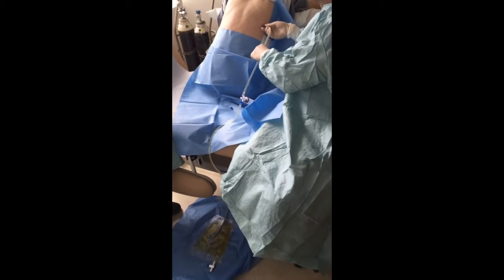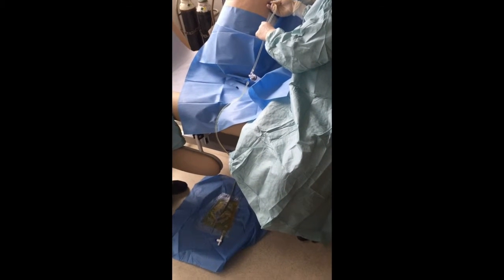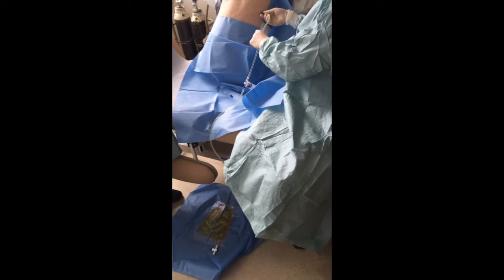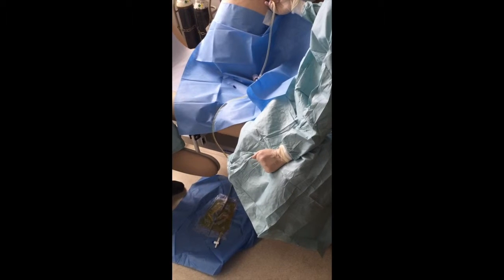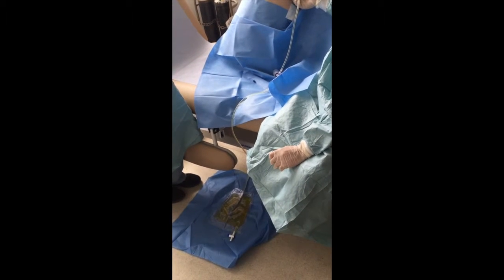As you drain the fluid off to get a therapeutic effect, if you drain about 500 mils off, that's about a tidal volume, so you get a therapeutic effect at 500. So you can drain up to 1.5 litres in one go, but we only want to drain 1 litre off because if we need to do something else, we need fluid in there.